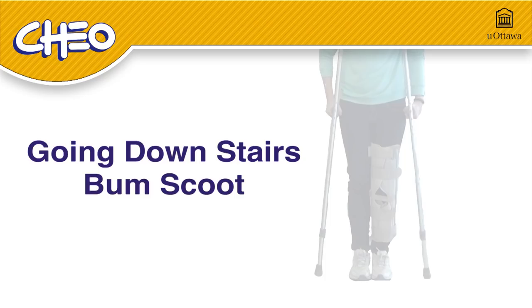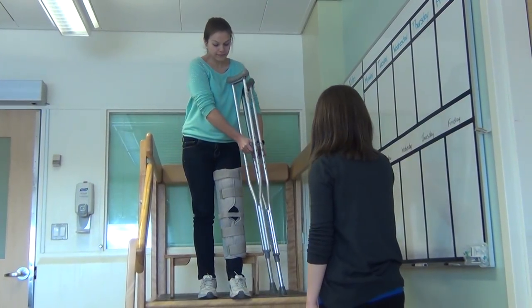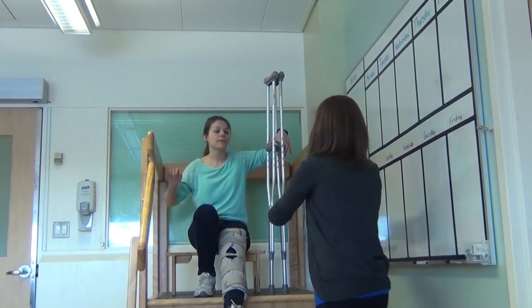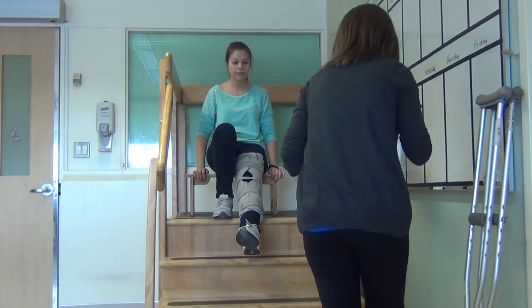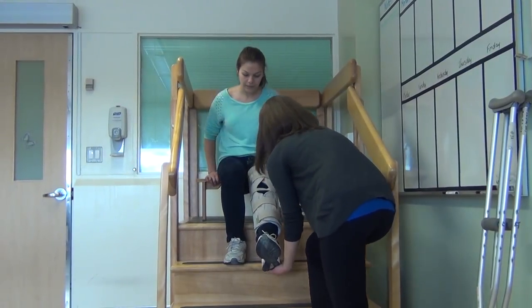Going downstairs — bum scoot. Start by lowering yourself carefully onto the bench by holding onto the railing or an adult with one hand and your crutches by the handle in your other hand. Give your crutches to an adult to carry down the stairs for you. Move your good leg onto the stair below. Follow with your bum by putting your weight on your hands and moving your bum down a stair.